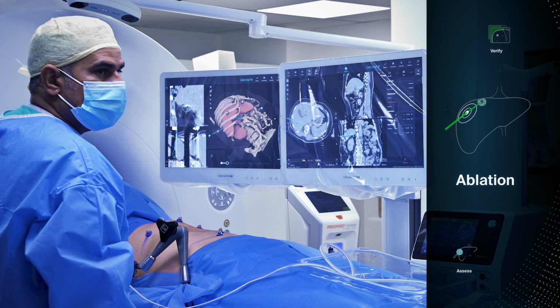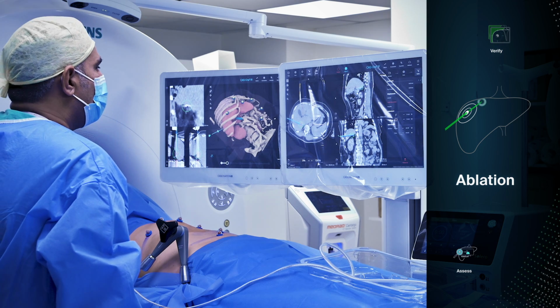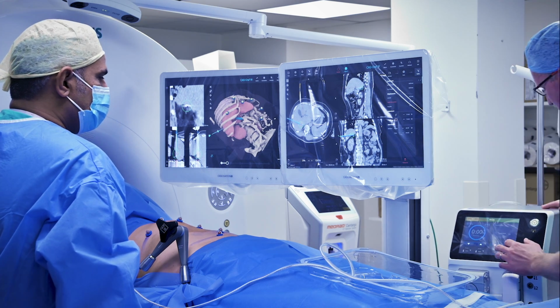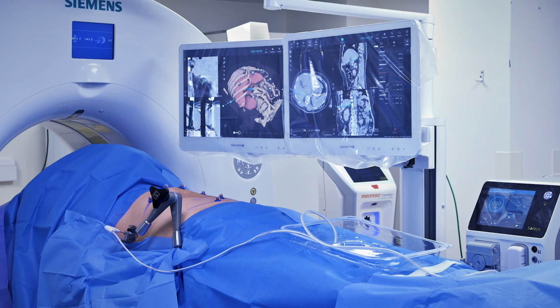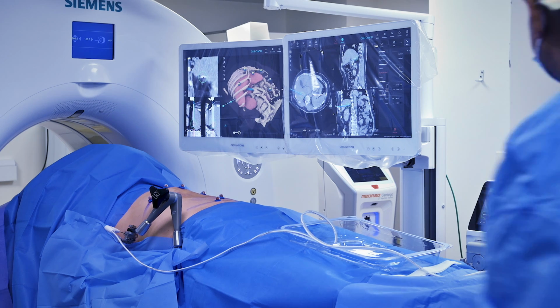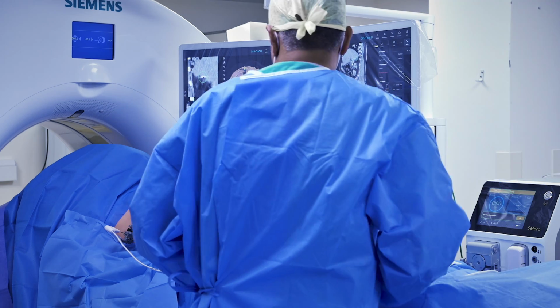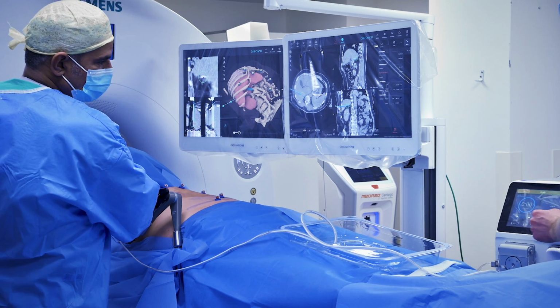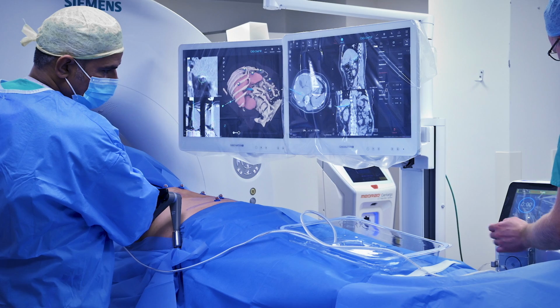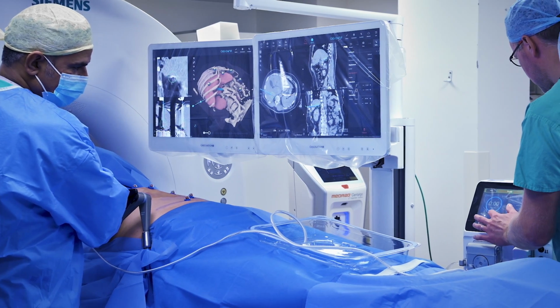Okay, can we go 140 watts? Because of the lateral deviation, I'm going to set it to 3 minutes rather than 2 minutes. Okay, you happy, David? Okay, so we're going to track ablate now. So track should be, if you give me about 20 seconds, I'd say.